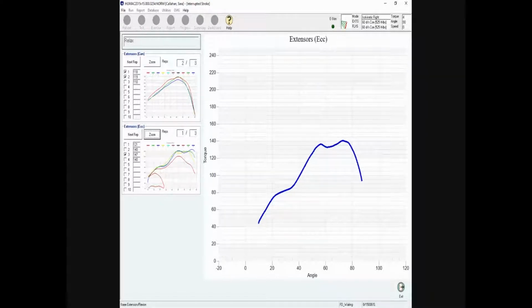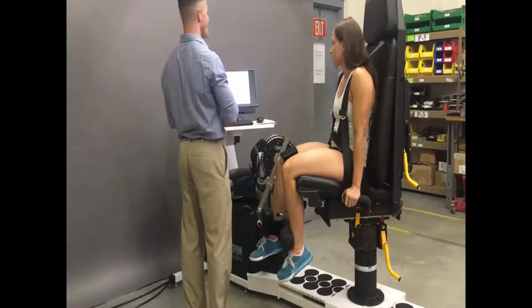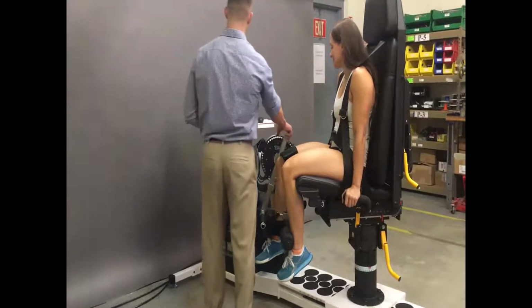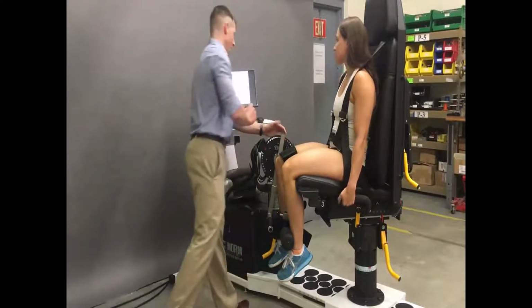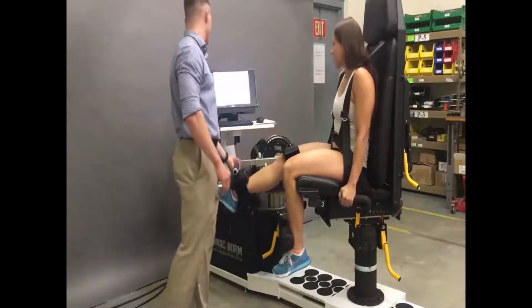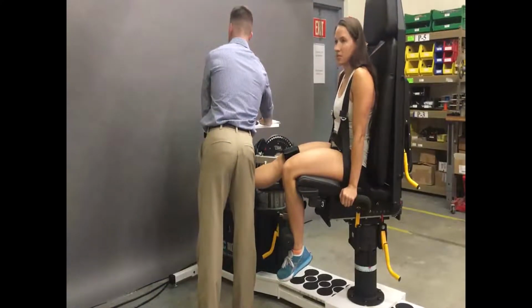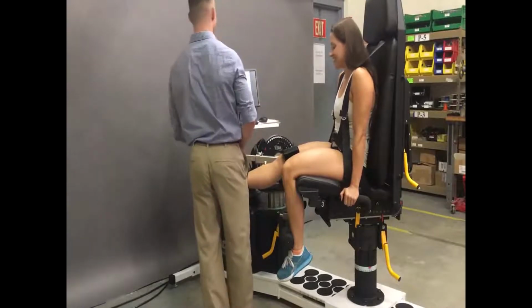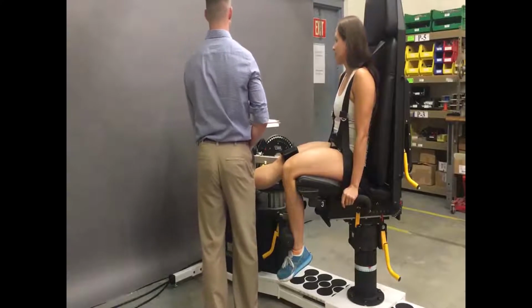Sometimes you get an athlete that just knocks out 3 good reps in a row, and if that's the case, always take a couple more just to see if that's truly their maximum. If you start to notice your athletes getting fatigued, usually around rep 3 or 5, give them a little bit extra time. Another 20, 30 seconds, or even up to a minute can really help them get the best reps that they can give you.